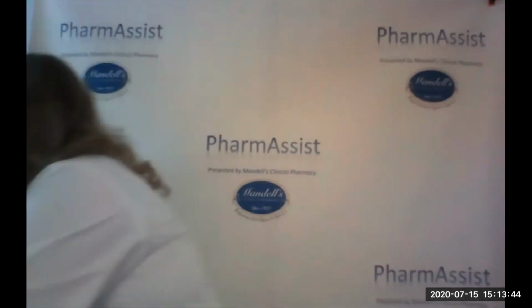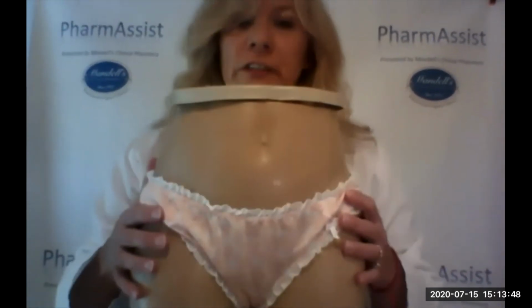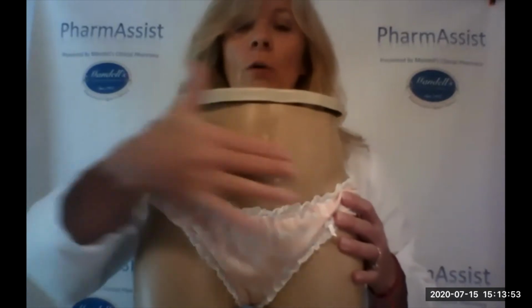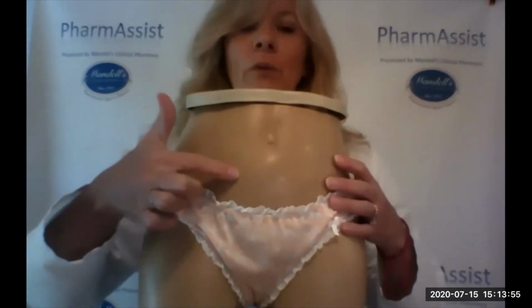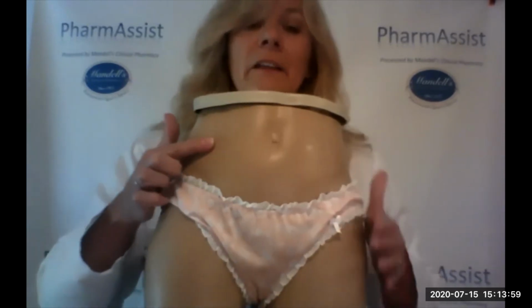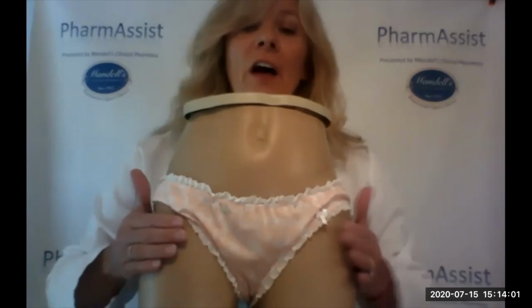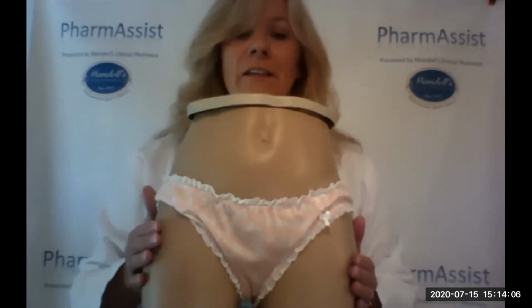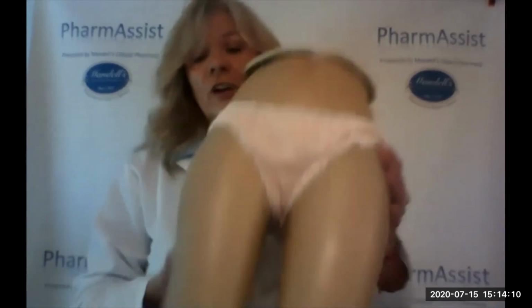I'm not going to uncap it yet because I want to show you where this injection goes. With the help of my injection mannequin, I want to show you that for this injection, typically you're going to use the lower abdomen, the lower belly below the belly button. This is a one-time shot, so it can go anywhere in this belly. The other area to use is your upper or outer thighs, because again, this is a fatty shot, so it just needs to get into that subcutaneous tissue. This injection can either be self-injected or you could have somebody give it to you.